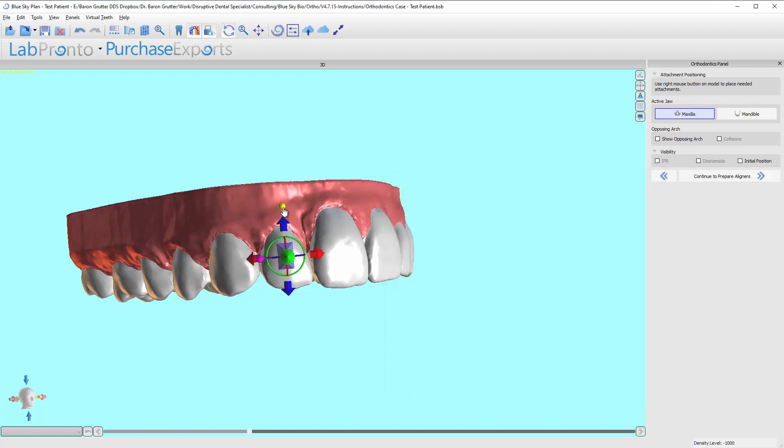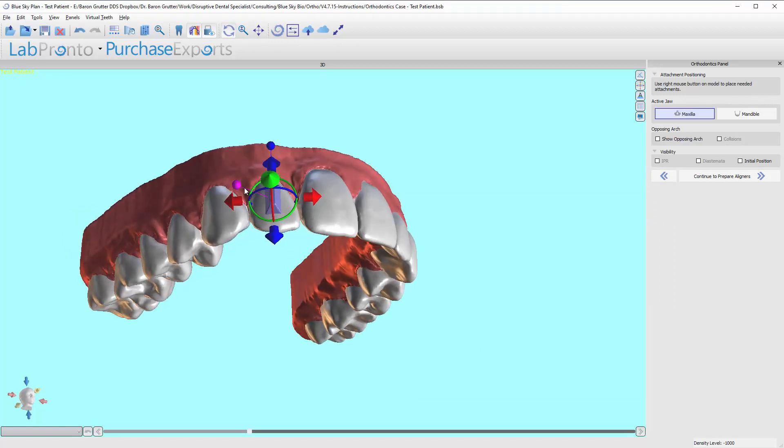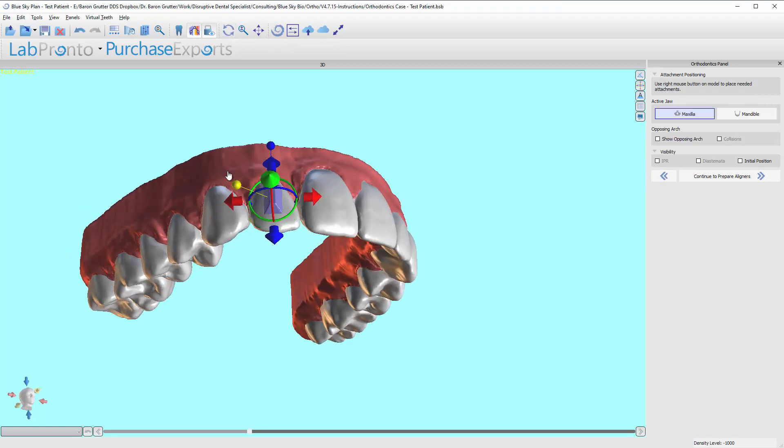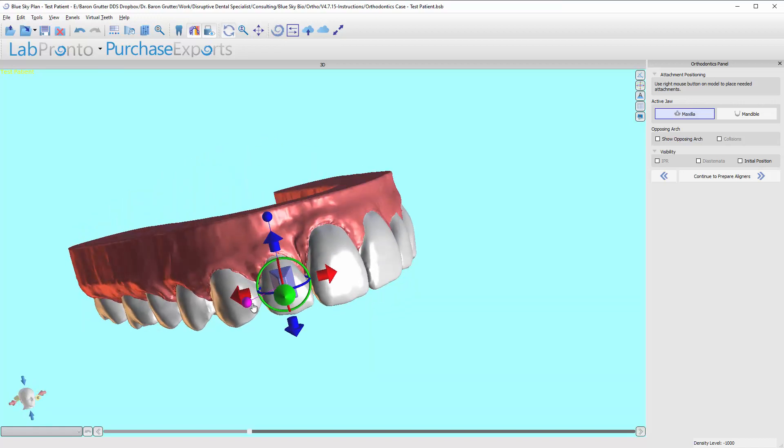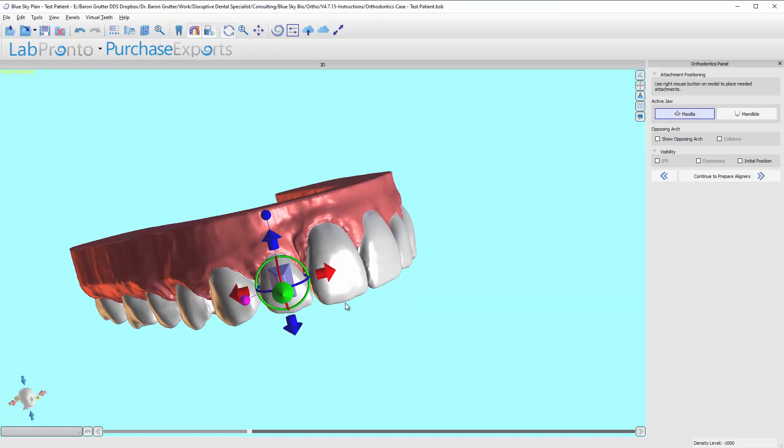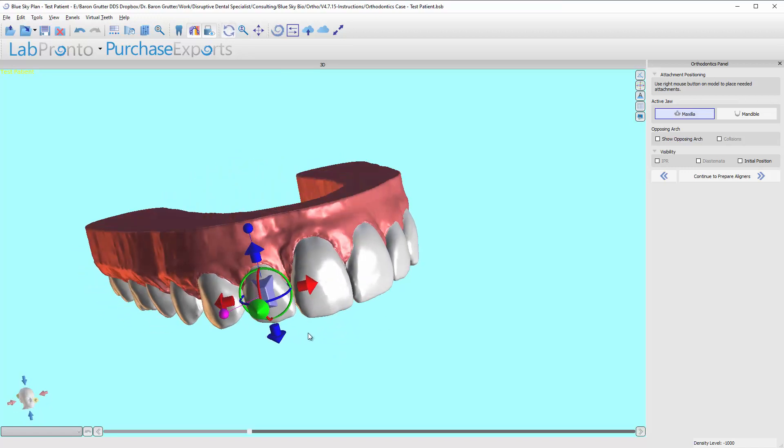And now we have the ability to scale it taller and fatter and thicker. So I tend to make them a little bit thicker, a little tall. And I keep them pretty well centered in the middle of the tooth. And I usually push them into the model a little bit.